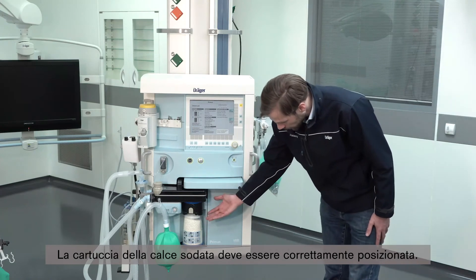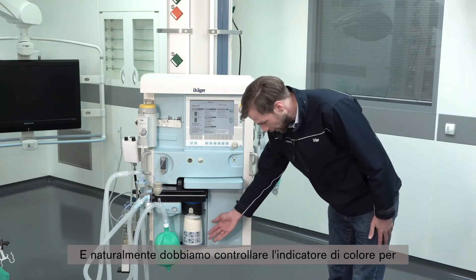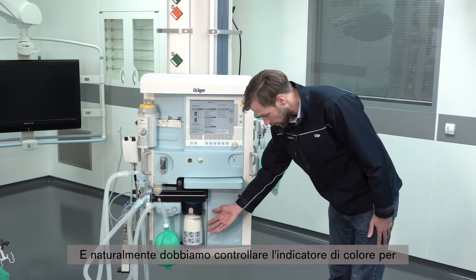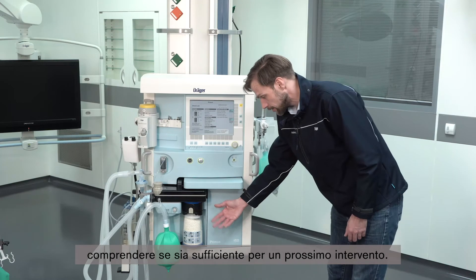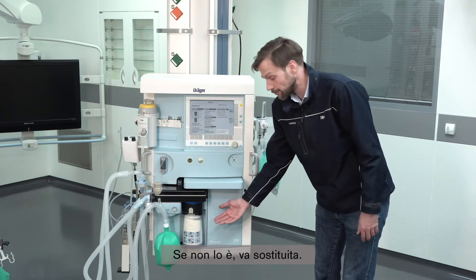Next we should have a look at the soda lime canister. It should be correctly in place, and we should check if the color indicator shows that there might not be enough capacity for the next case. If that is the case, we have to replace it.